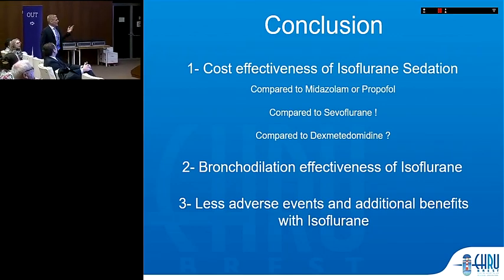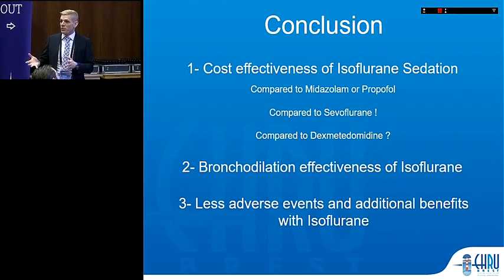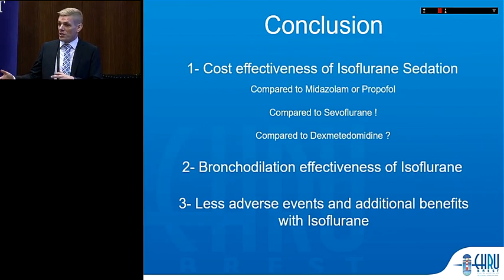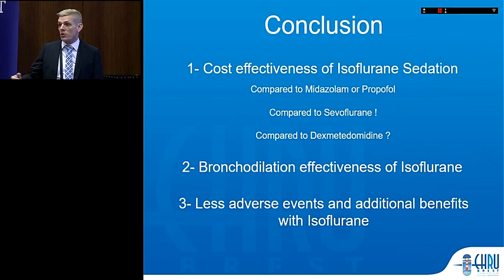I can give you also an answer. This is why I asked about transportation. We go on transport always with volatile; 90% of the patients are on volatile. If the patient is difficult to manage, we use the ICU ventilator with the scavenger system, otherwise not. We were measuring along the way to the CT scan, and then within the CT suite, we were measuring the concentration, and we could not detect any. When we were measuring within half a meter of the patient, we were getting 1 or 0 ppm. We also needed to do the occupational hazard study, and it's not a problem within the ICU, and also in the CT suite.